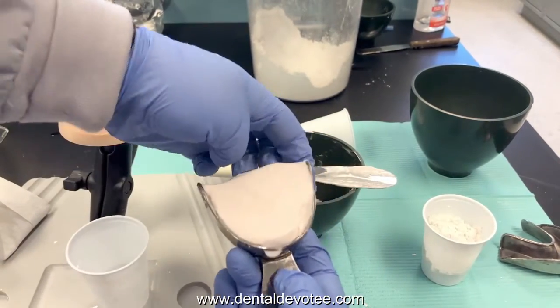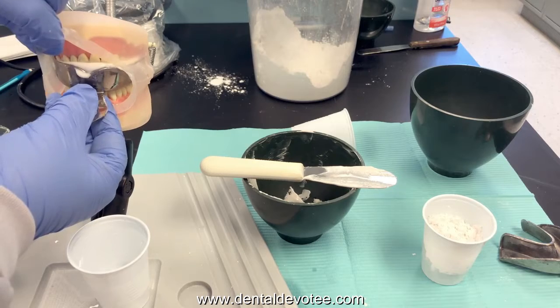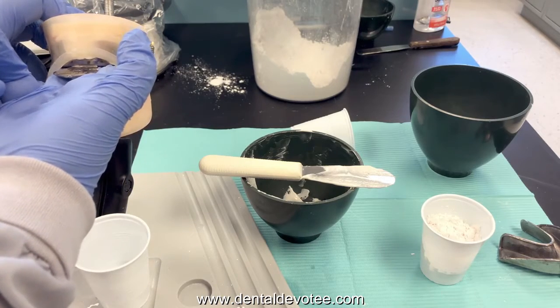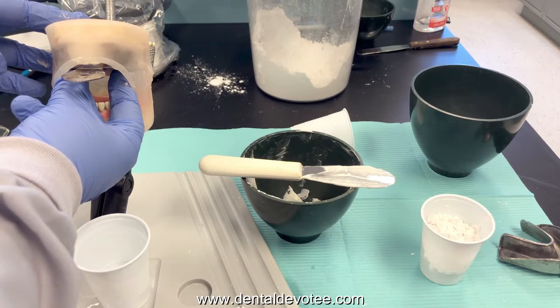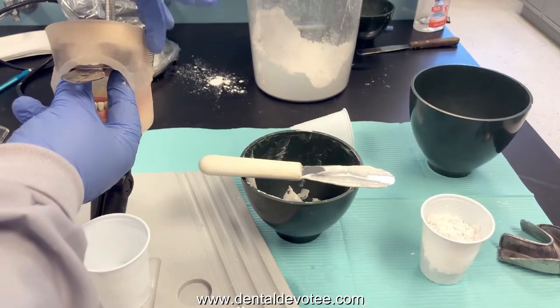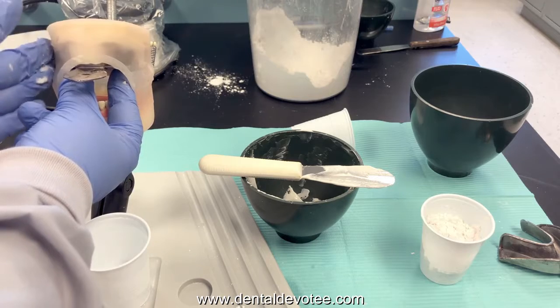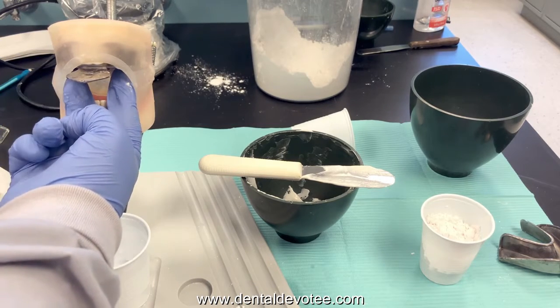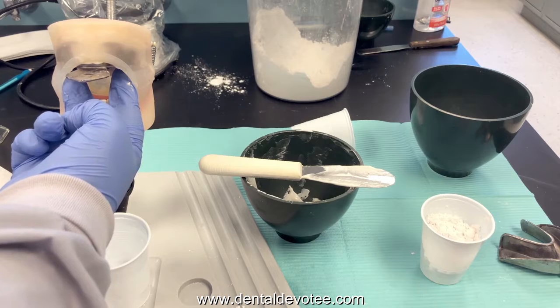Remove your gauze. Take a little excess material and wipe it on the occlusal surfaces of the teeth. Insert your tray at an angle, press the posterior side up first, keep their lip out of the way and press into the anterior region. Once you've pressed the tray into position, hold it — we need to hold it until it sets. This material will take about one minute to set. After you insert, muscle trim: take your fingers and massage their cheeks and their lips. That will help the material flow up into the vestibule to give you a good peripheral roll. Support it the entire time — don't walk away. Have equal pressure on the left and right side of the tray; gravity can cause it to fall down. Don't clean up your materials until the impression has set.